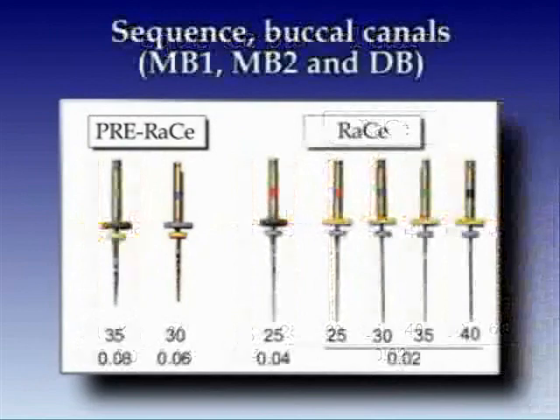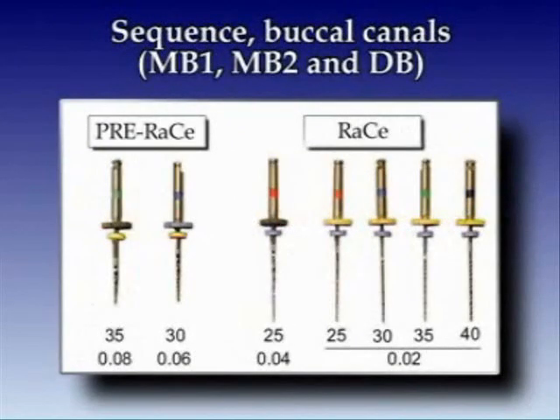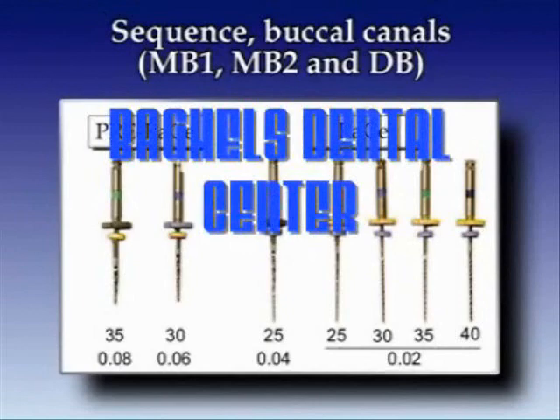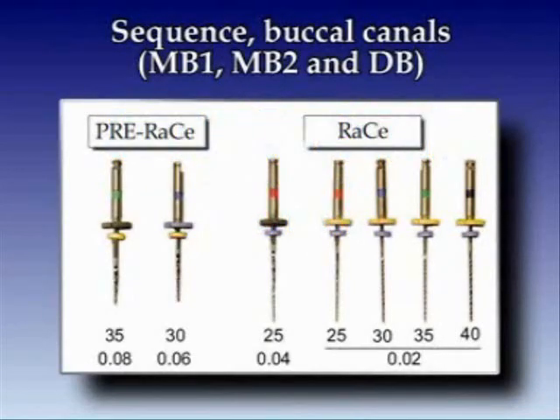The three buccal canals are of course narrower, and in these canals we use only the two smallest pre-flared instruments. We plan to use one 04 taper instrument in the mid portion of the canal and then 02 taper instruments apically to size 40.